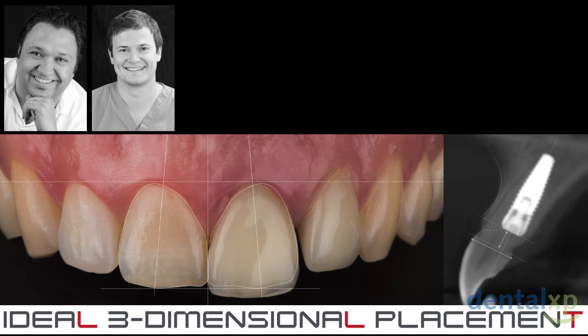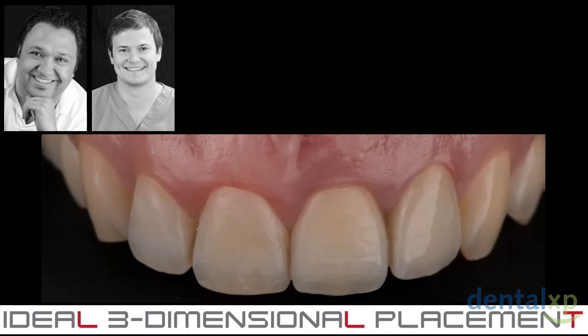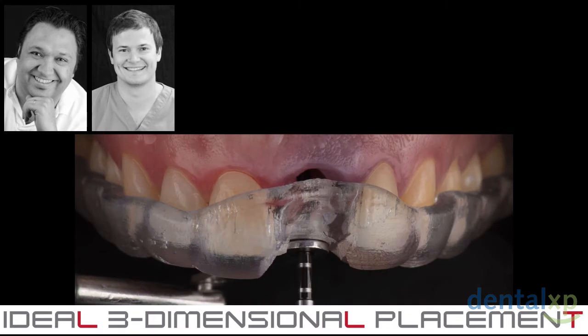It's essential to assess the size of the tooth to replace and to relate it to the diameter of the implant, the type of implant that we are using, and the features of its connection, as well as to visualize the future emergence profile. All of this is very nice in theory, but how can we transfer this virtual planning to the clinical reality to obtain a clinical success? Let's talk about guided surgery and let's see what it can do for us.